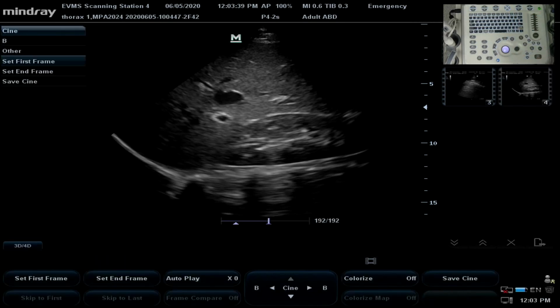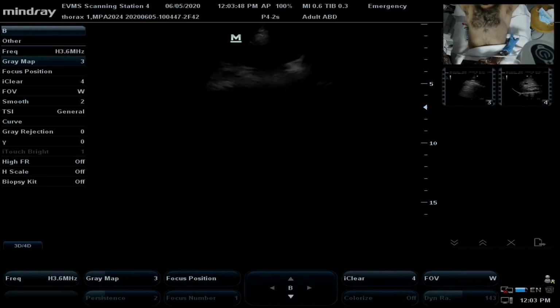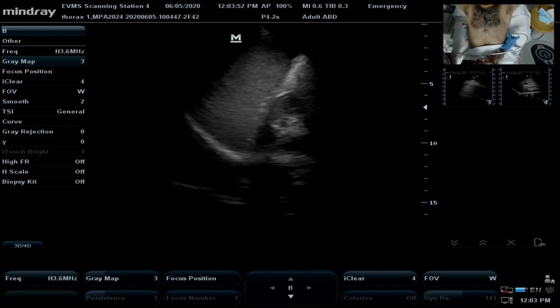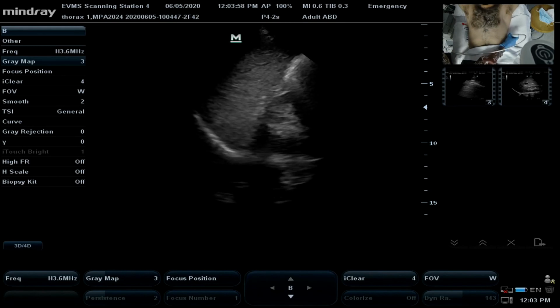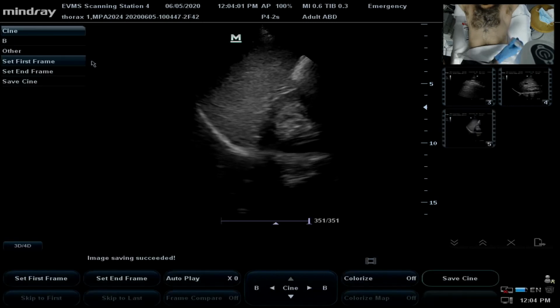Now I'm going to reach over to the left side. I see spleen, so I know I've gone superiorly enough. I'm going to rotate a little clockwise to try and pull in this interface a bit better. I see no fluid. Done. Now I'm going to come inferiorly, some gel.